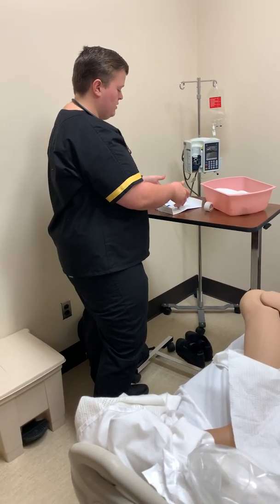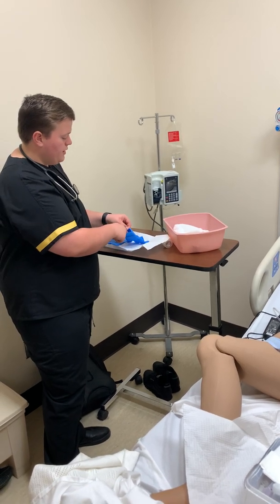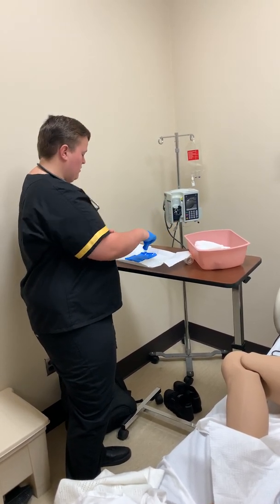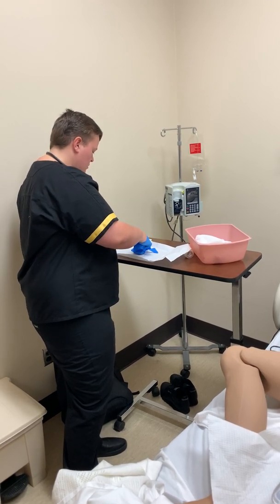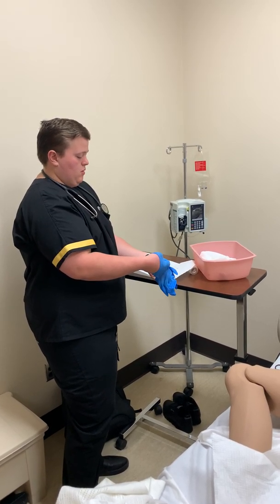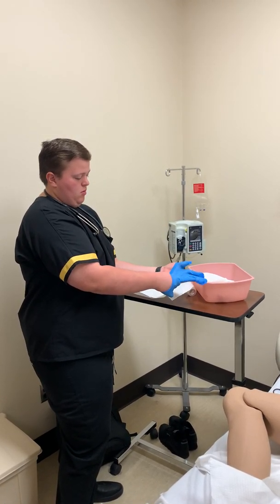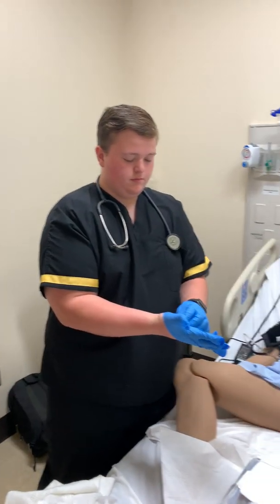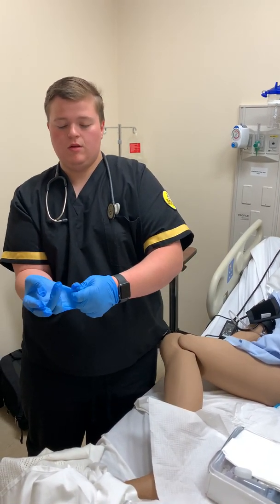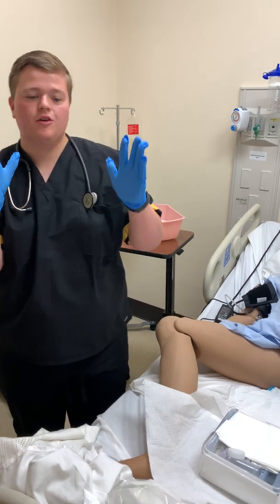Out, close, then two fingers, open it up, a little pinch here, and sterile can touch sterile, so we are able to pinch the fingers and get everything on there correctly.